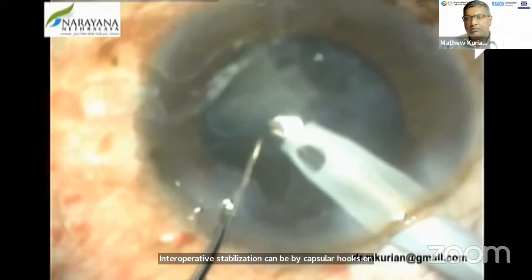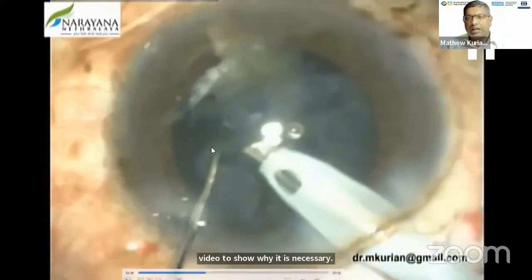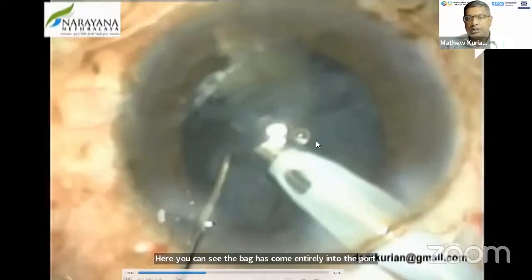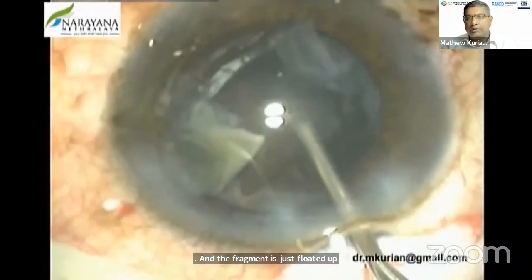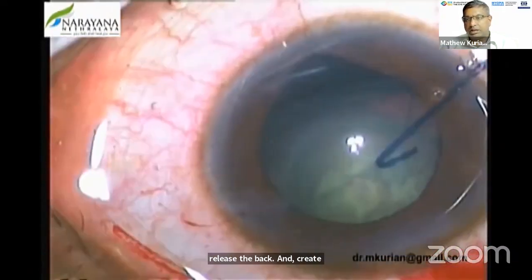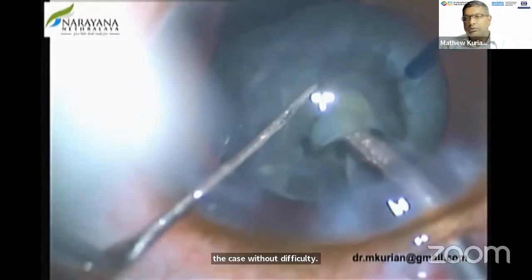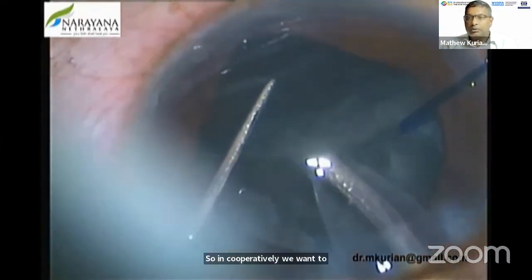And then this is a video to show why it is necessary. Here you can see the bag has come entirely into the port and the fragment is just floated up. Fortunately, nothing goes behind, and we are able to release the bag and create space there and complete the case without difficulty.